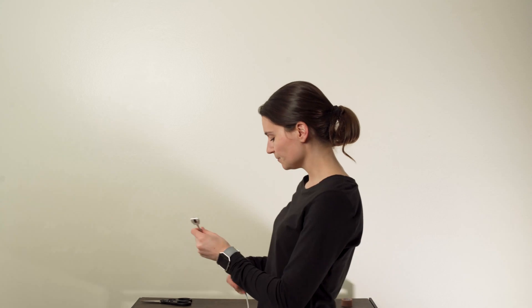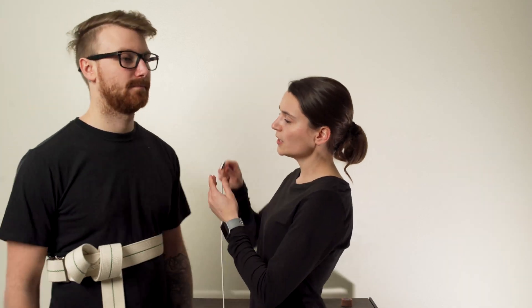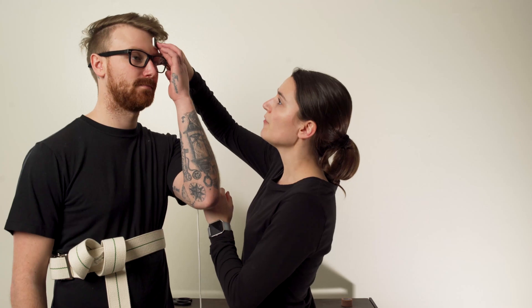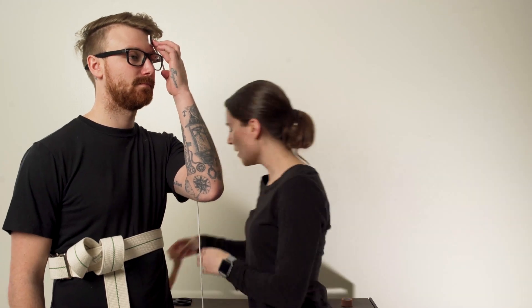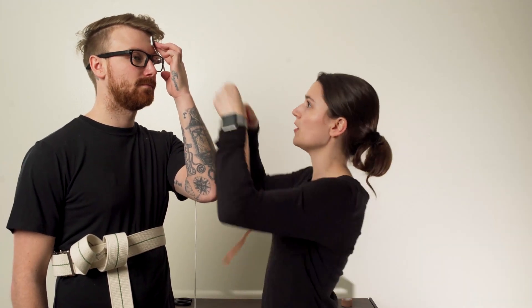Next, I'll show you how to secure this to the patient. The sensor is going to go directly above the patient's eyebrow. Have the patient hold on to it while you grab a strip of Coban to secure it around their forehead.